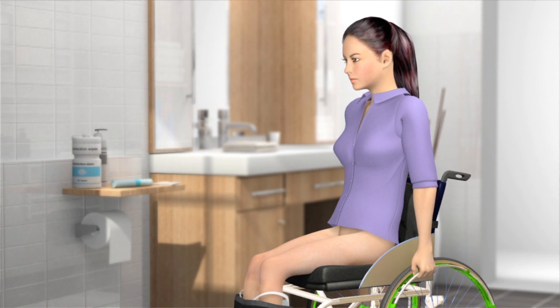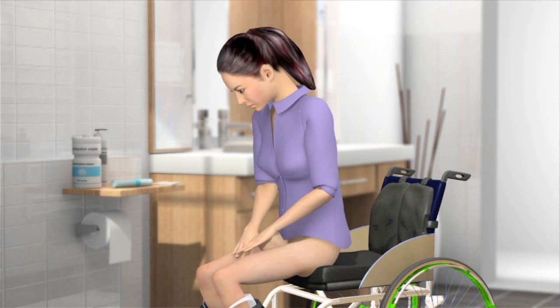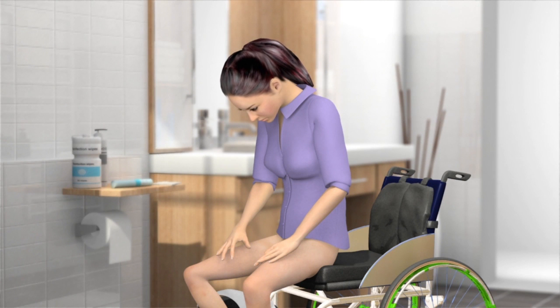Pull your clothes down so you can move freely when doing the catheterization. Push yourself forward in the chair so you can spread your legs to allow for easy access to the urethra. If necessary, hold your legs apart with a device developed for that purpose.